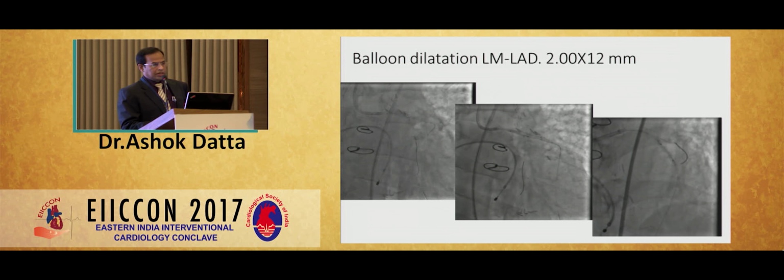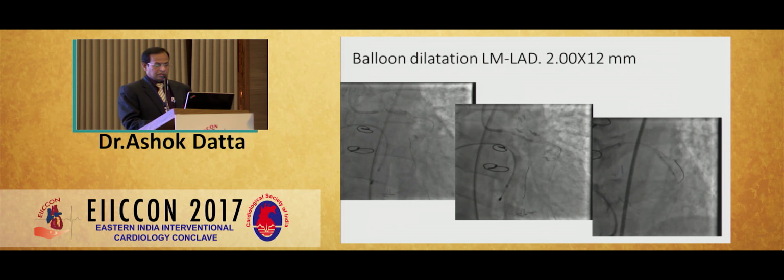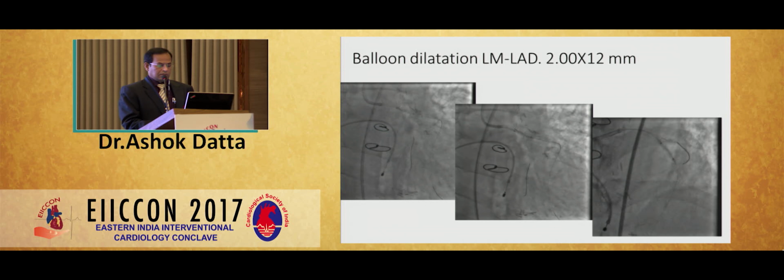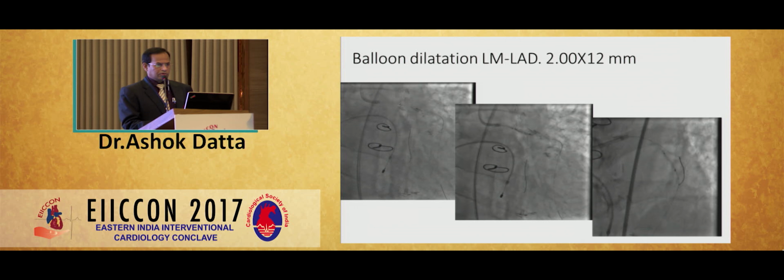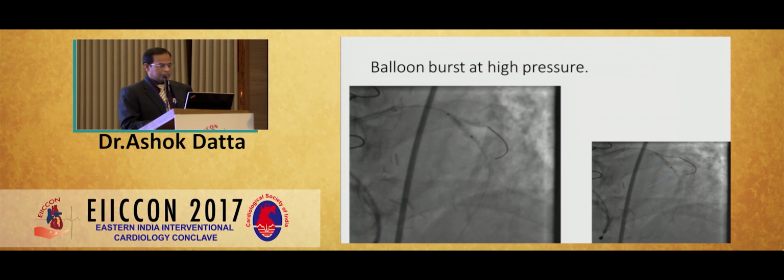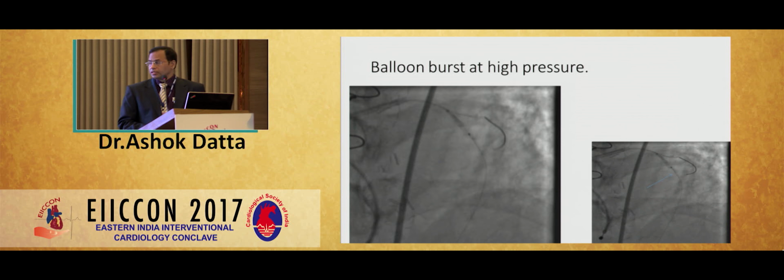So now balloon dilatation with a 2 by 12 millimeter. It was difficult to inflate the balloon totally. It was not uniformly dilated. So at one stage the balloon burst. You see on the right side.